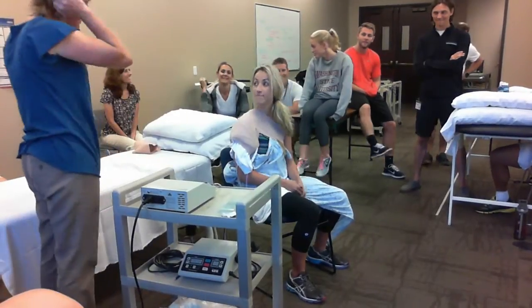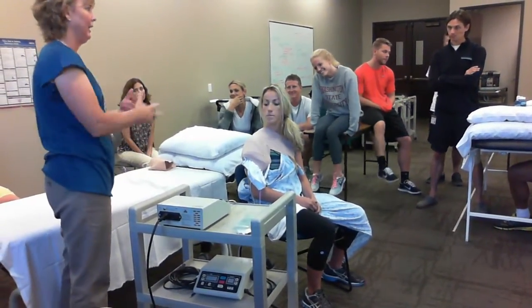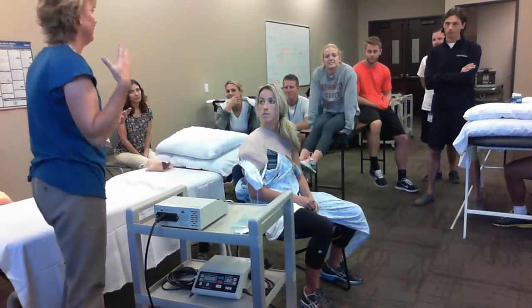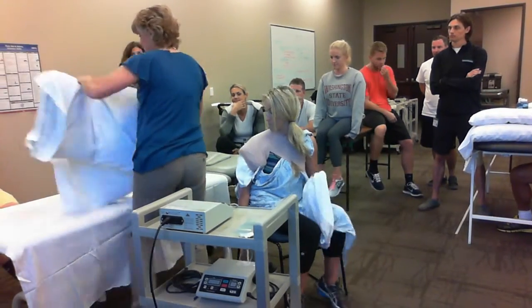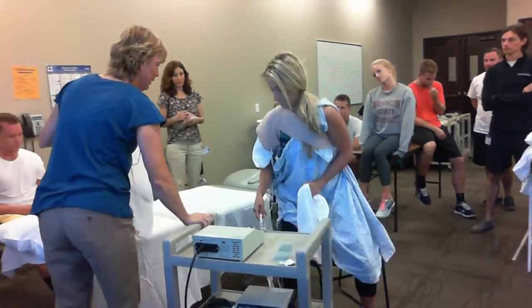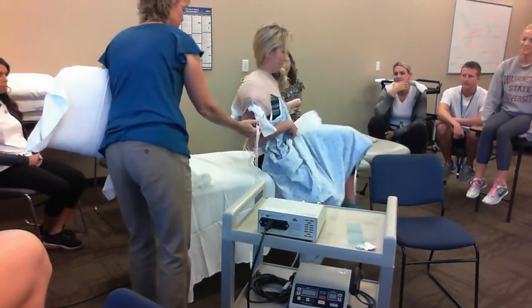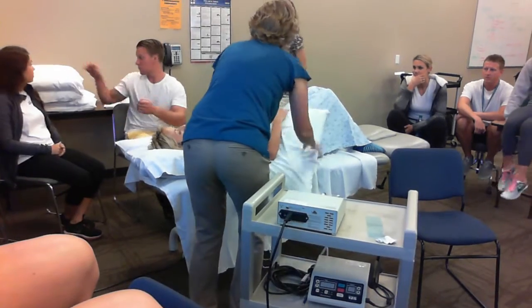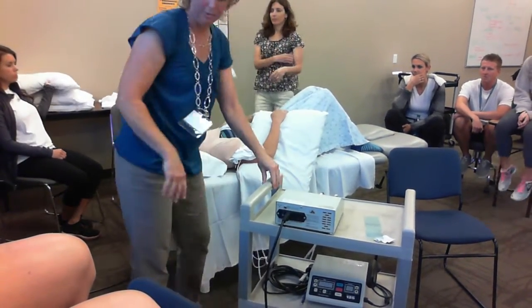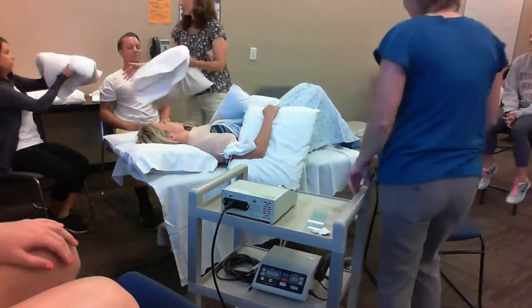Now, at this point, I would probably lie her down, okay? Because I don't want to turn the intensity on and have her try to maneuver with this and that current flow. So, I'm going to change the pillow. I'd like you to be here, close to my machine. Back there. Thank you for moving your shoes. Get that arm supported, and she's going to pillow you up. Would you like a drape? Just throw them on the patient.